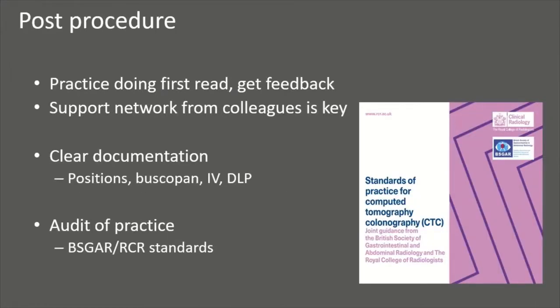So what can you do after a procedure? Well, a key thing I think is practicing doing the first read. Go through the study, try and identify pathology and get feedback from your reporting radiographers or radiologists. It's really important to have a good support network from your colleagues, as this will help develop your interpretation skills for the on-table review, and this will in turn help develop the quality of the imaging obtained and also when to stage patients.